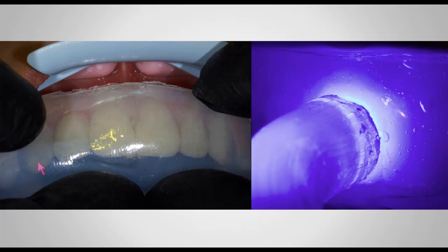So you can see I have everything inside. The flowable composite has spread and wet the entire surface of the enamel. I'm sure I'm having a little bit of excess, but you'll see how small the excess is because of the way that this impression material copies your wax up and the cast with so much detail. It's just a very thin layer of excess that you're going to have on top.